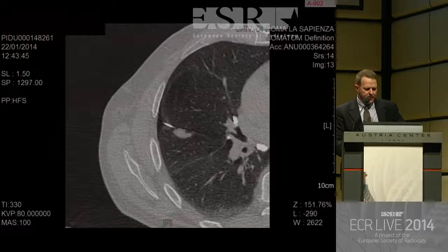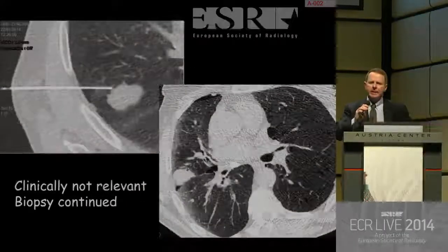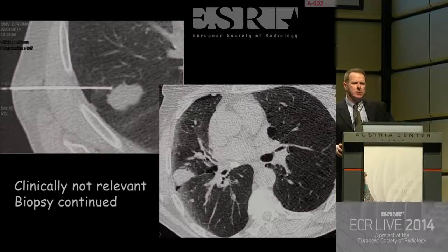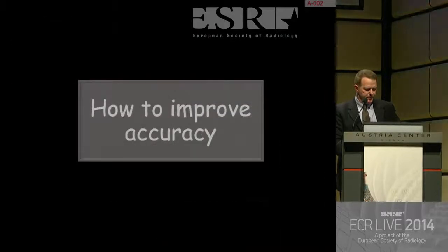Okay? So what to do? The pneumothorax is not clinically relevant. The lesion is stable. The biopsy is continued. And this is the follow-up at 1 hour. You see there is not increasing pneumothorax. So not clinically relevant. But despite that, an error, a mistake was done.